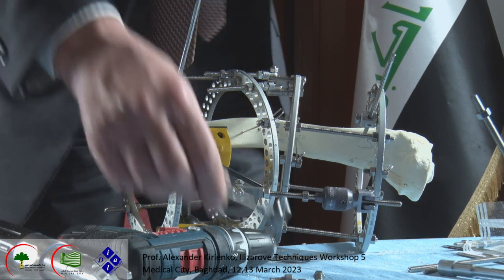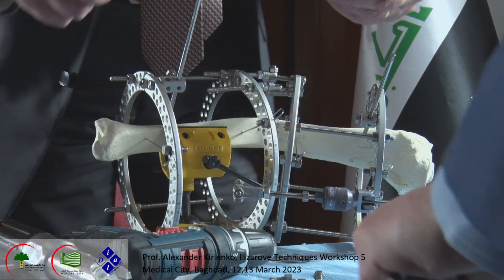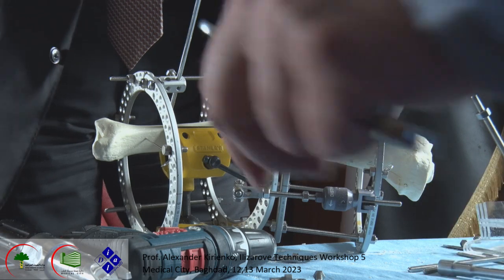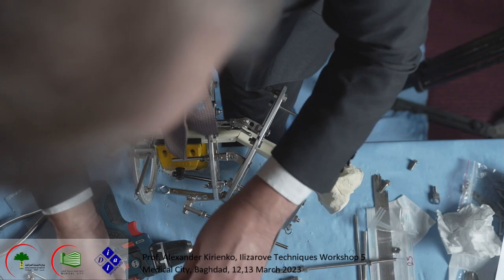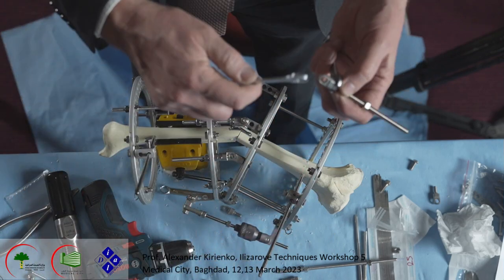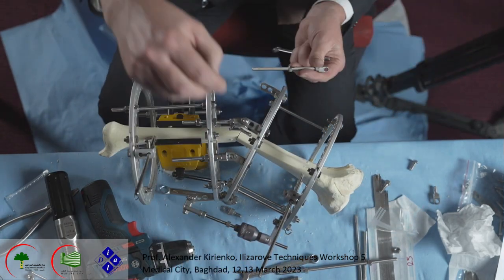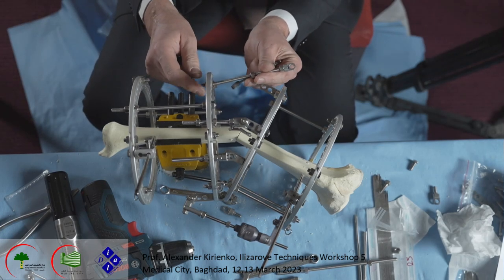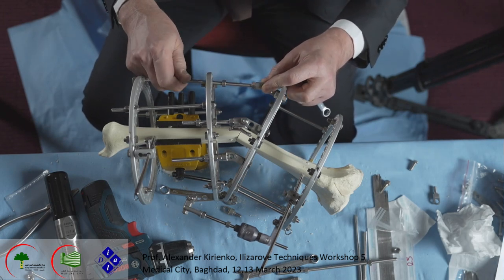It's a little bit short. Put another one with female. Female, 3 holes? No, one hole. One? It's only for more length. Okay. No, a small one. Too short. Okay. Give me a range. Thank you. Okay. I put it medially. Only to show you. We should respect the symmetrical position of the holes.